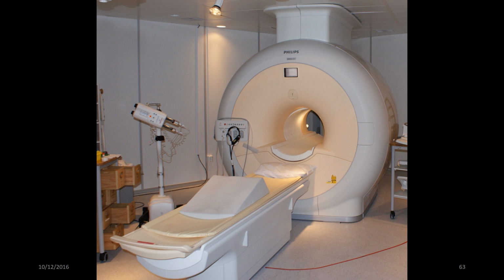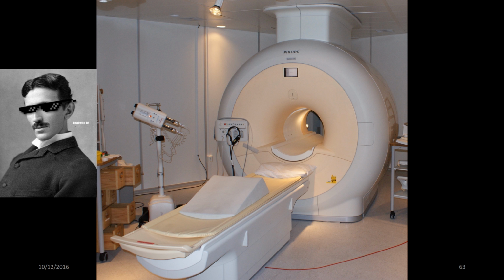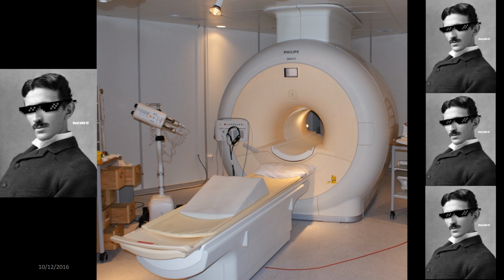MRI scanners use basically a huge magnetic field, 60,000 times stronger than the Earth's own magnetic field, and it's measured in Teslas. Tesla was an eccentric scientist, and your average MRI scanner is between 1 and 3 Tesla rating. The strongest field strength MRI ever generated and stable is 91.4. The highest one used for actual human beings is about 10 Tesla. The absolute strongest field strength ever achieved is in the region of 750 Tesla, but the equipment destroyed itself.